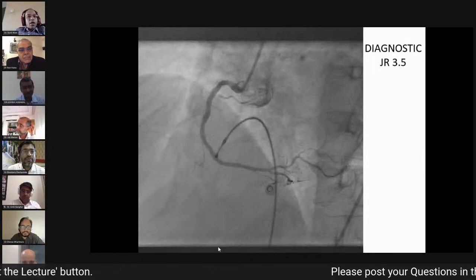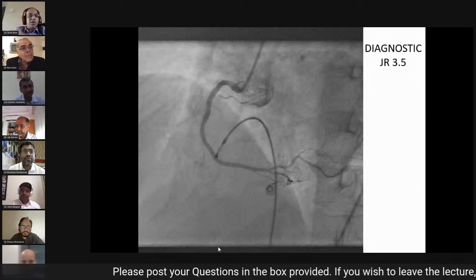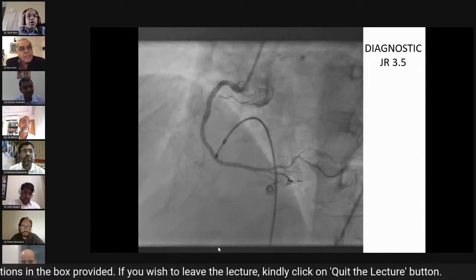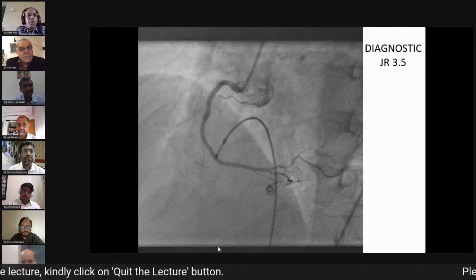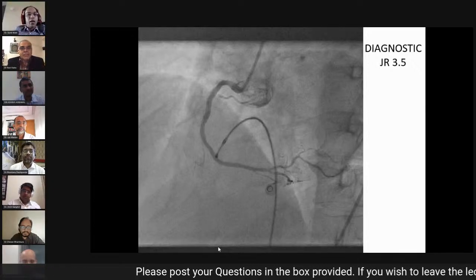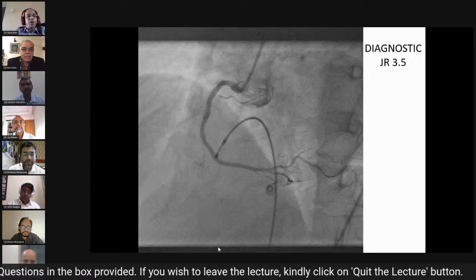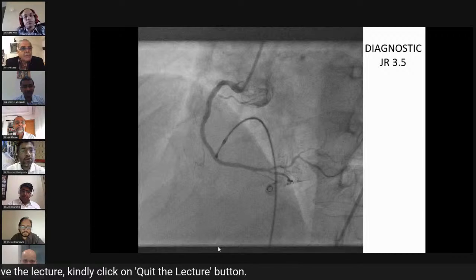One comment, Ashish has done an extremely good case, and I feel that, see, if your balloon has crossed, then going back to rota versus doing more of IVL, you have given 80 pulses, give more. That could have been one other option that you had. One more balloon, and then checking on the OCT and deciding how much area you have achieved, and then take a final call on the stenting. Yeah. Nice case, Ashish. We'll go to the next case now.